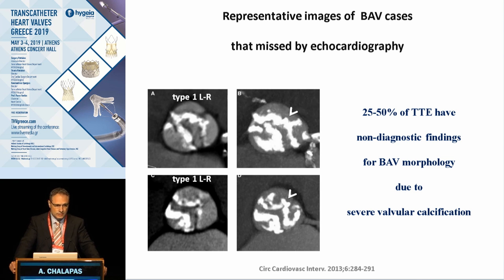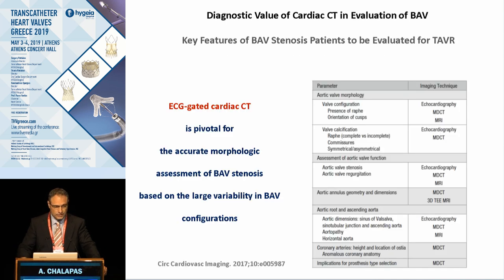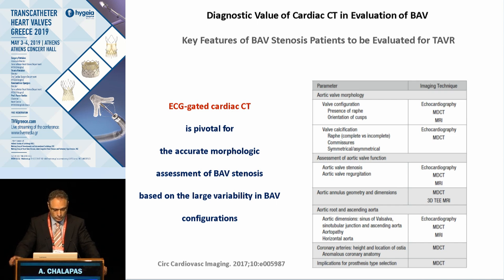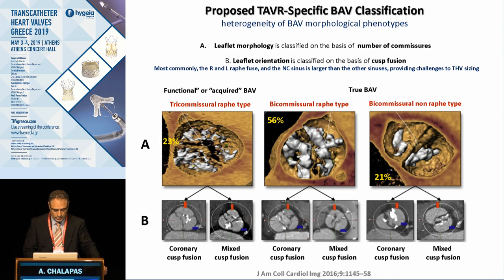Echocardiography, which is the initial imaging tool to evaluate such patients, can miss the true bicuspid valve in up to 50% of cases. Therefore, CT is the gold standard imaging tool to assess not only the whole anatomy from the peripherals to the aortic valve, but also to understand the different anatomical heterogeneities that occur.